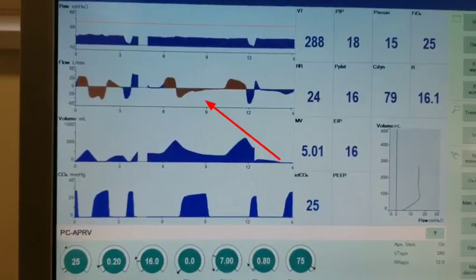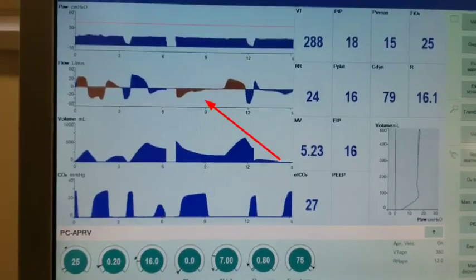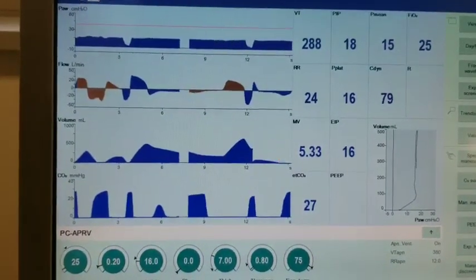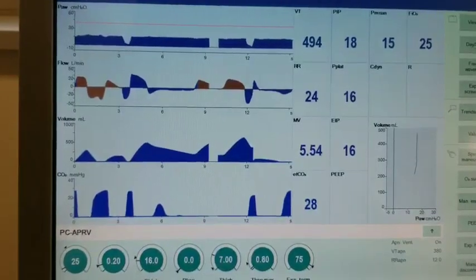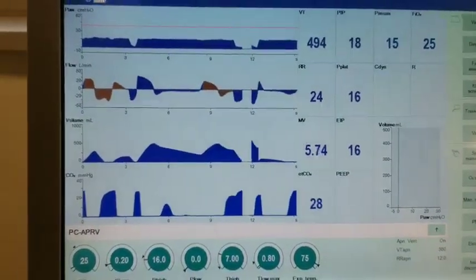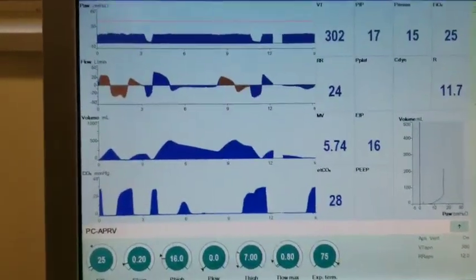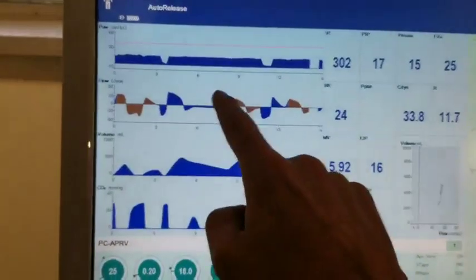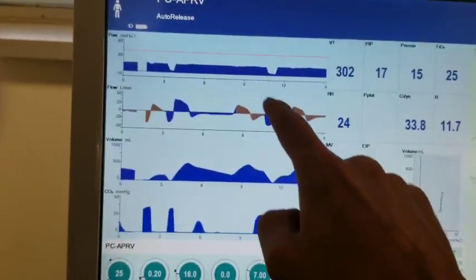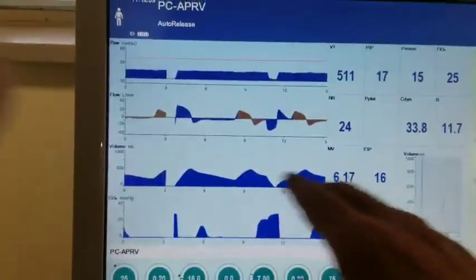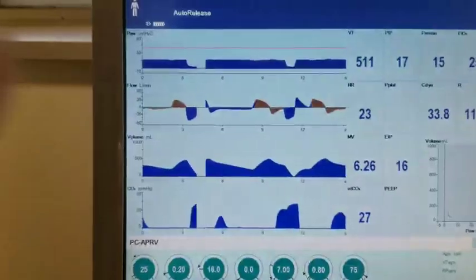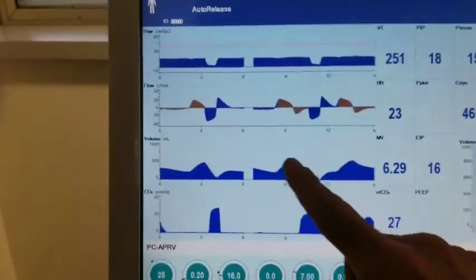So you see the flow waveforms. Let's look at the next one. They're nice and wide, not like these little subtle bumps that are frequent. That means they might be hyperventilating, breathing shallow.